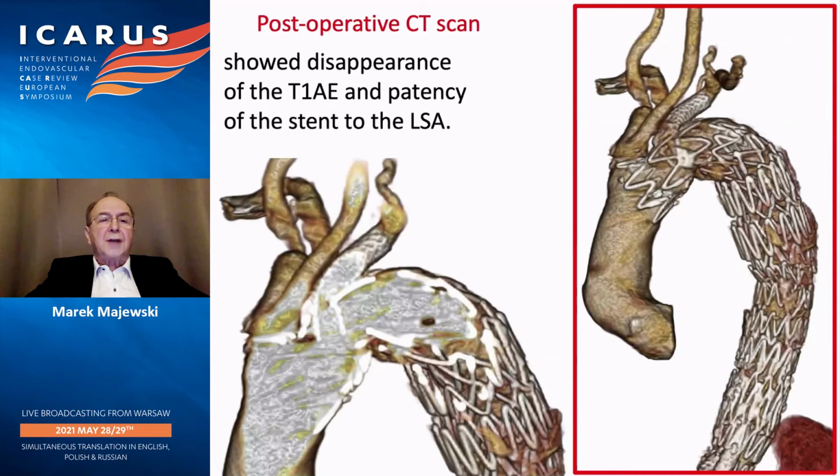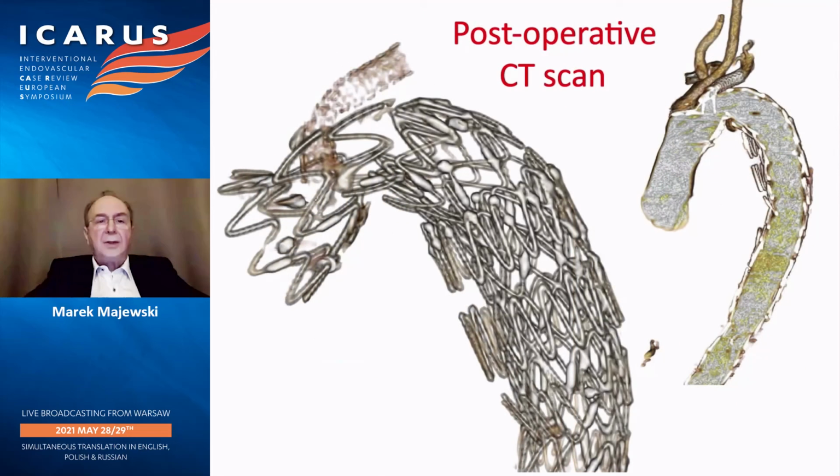Post-operative CT scan showed disappearance of the type 1A endoleak and patency of the stent to the LSA. This slide shows the stent graft and stent to the LSA.